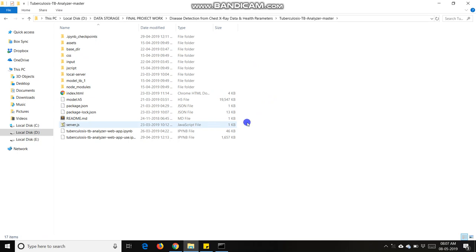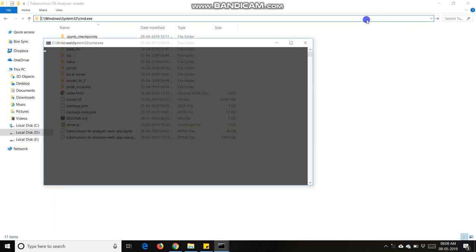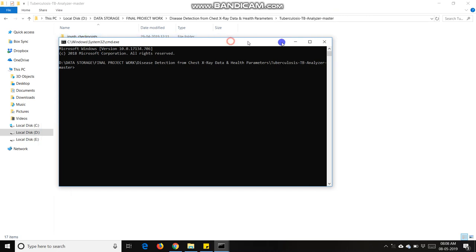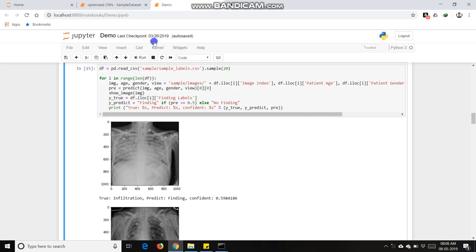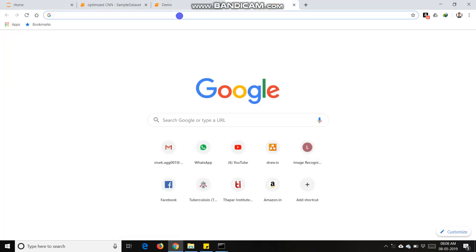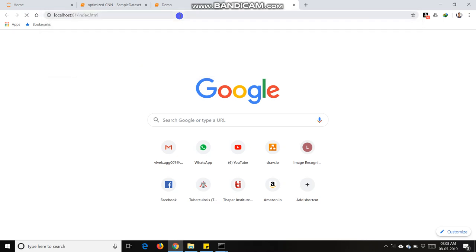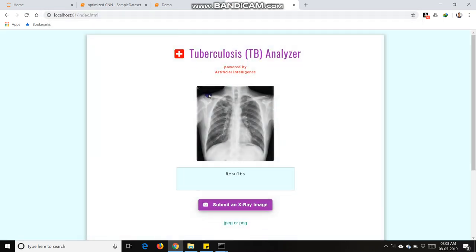There are some files in which I am going to start my server file. Just go to command line cmd, type command node server.js. It gets started at port number 81. It is an application which is made in Node.js technology.